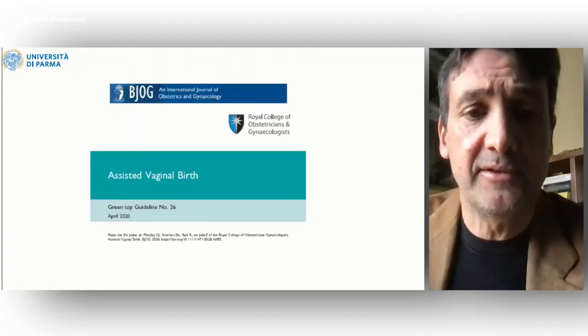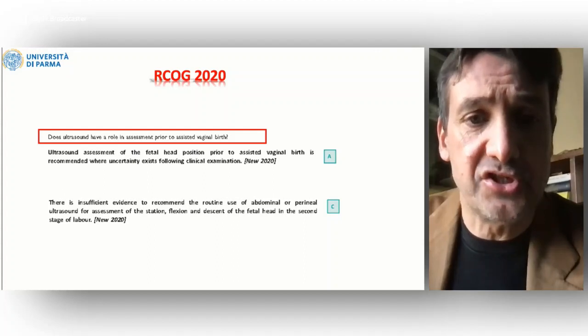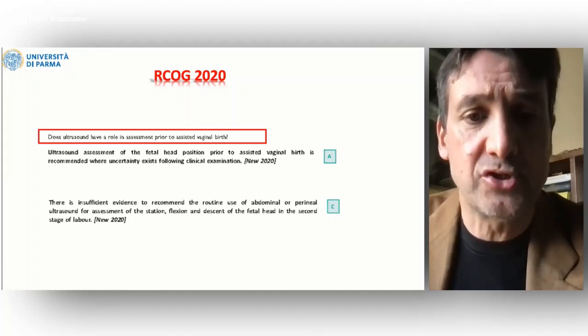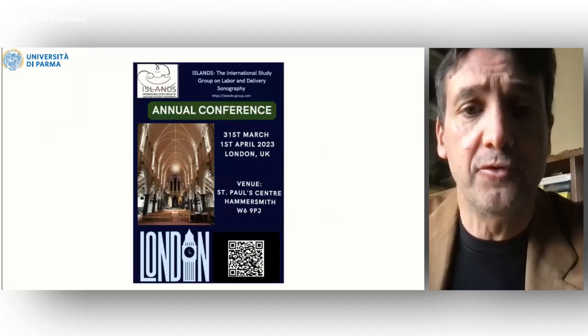We are pleased that clinical guidelines coming from the Royal College have recently endorsed the use of ultrasound before instrumental vaginal delivery to assess the fetal head position whenever uncertainty exists, while there is still some reluctance to include also the measurement of the fetal head station, although we think that this maybe will be one of the forthcoming steps.